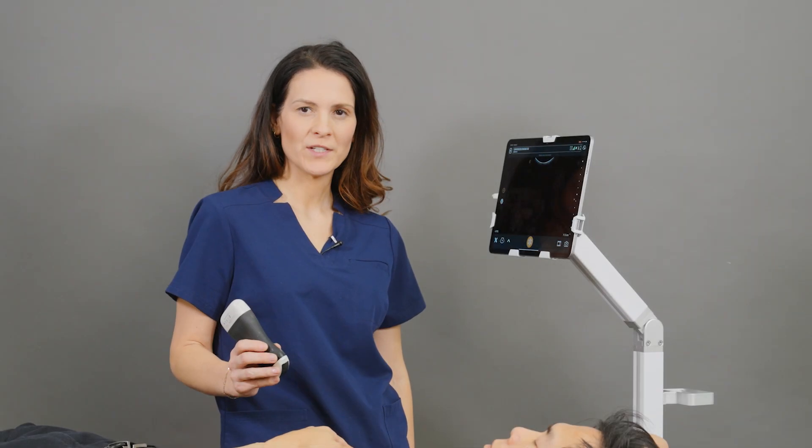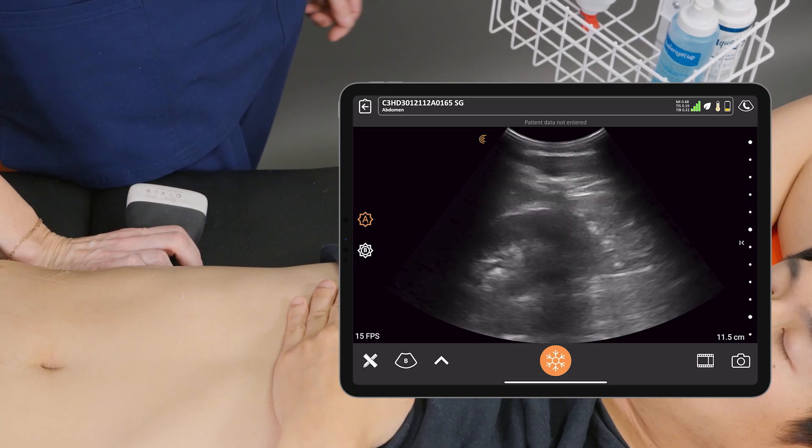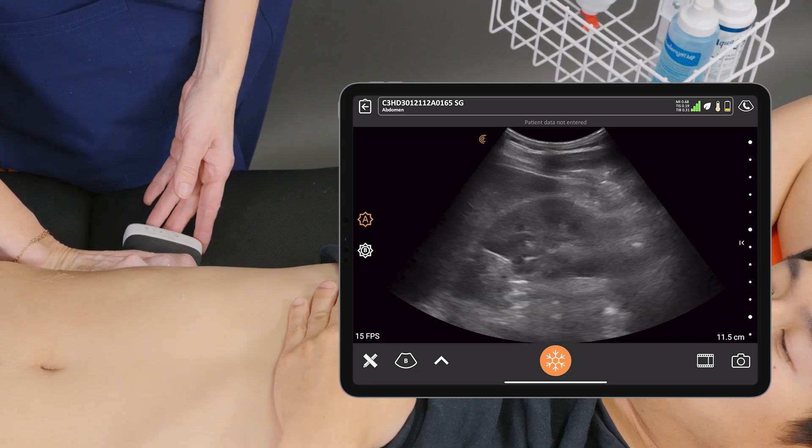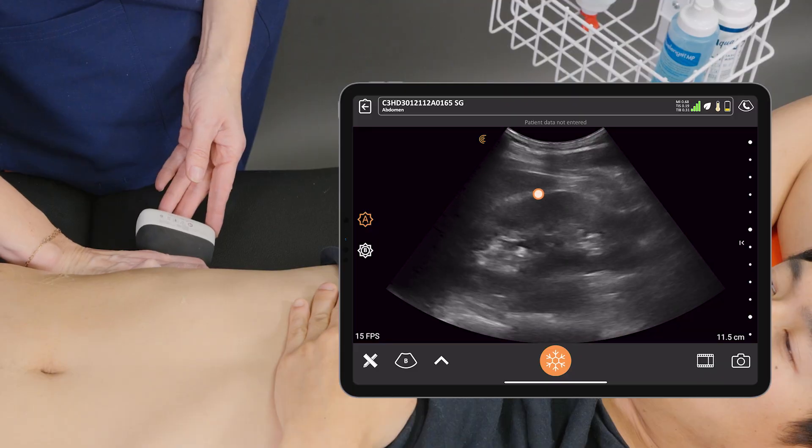I'm going to start with my patient in a supine position and we're going to scan the right flank. We're going to come a little bit more posteriorly and we can see the right kidney in a sagittal view.